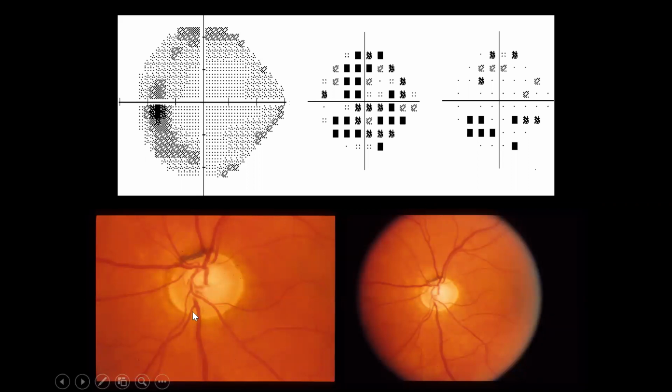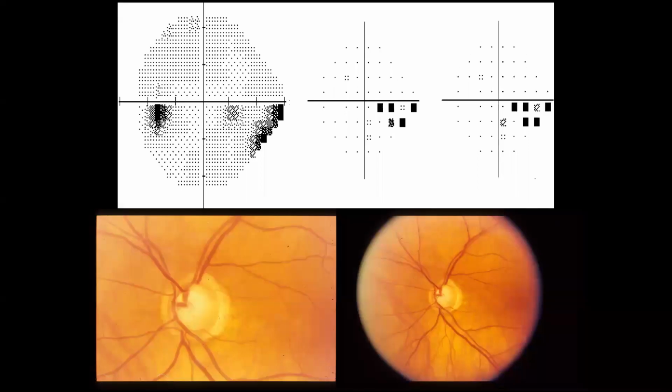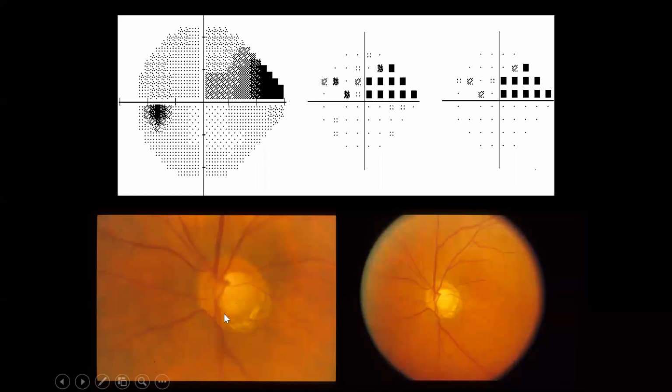Now, whenever you look at an optic nerve head image, you need to assess the disc very well and look at which area of the disc is having the maximum thinning, so that you can think about the area of the next hit in the visual field. And the main aim, as we mentioned, is to look for the area of the hit in the visual field and to plan your management appropriately based on that. If you are having a rapidly progressive visual field defect and you are keeping the patient on anti-glaucoma medication, then you would rather change your modality of treatment, think about other options like surgical intervention.